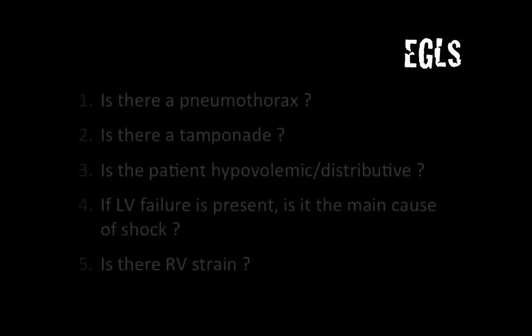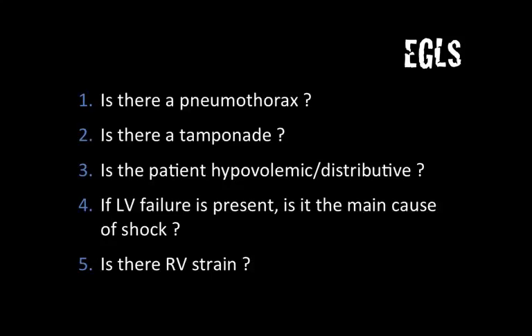Wondering why your patient is in shock? The EGLS algorithm may hold the answer. Let's now look at the examination sequence needed to answer these 5 clinical questions.